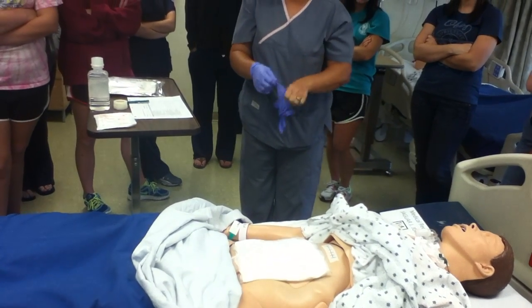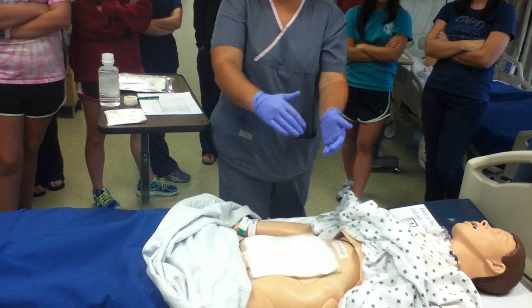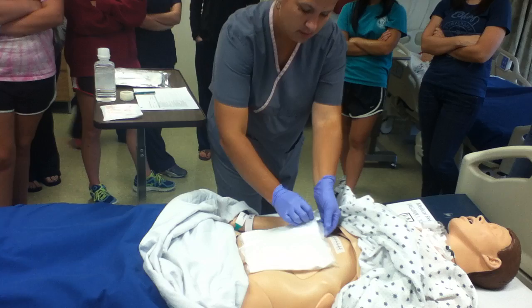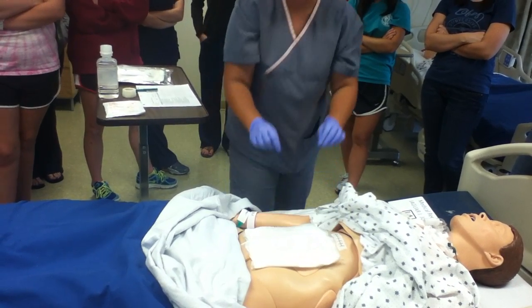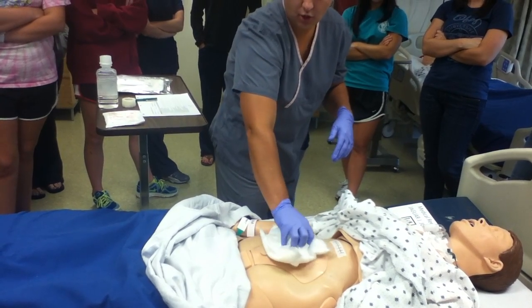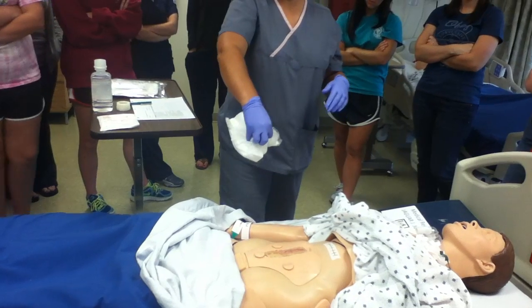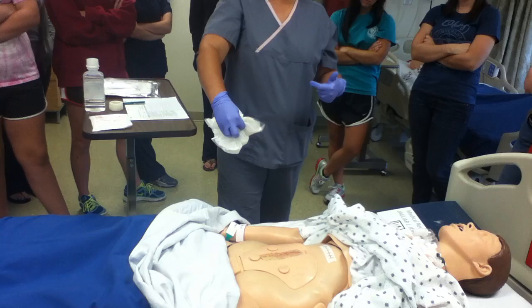Now I'm going to remove the patient's dressing. You are supposed to take the tape and come towards the center, so ease the tape off. This comes off very easy because there's been a lot of practicing. Then I'm going to turn it away from the patient, because I don't want to fan what's in there in the patient's face. They don't want to see that. But do I want to see it?